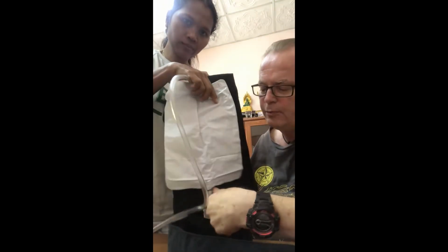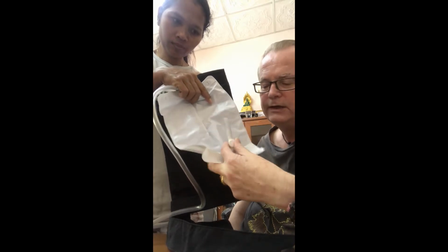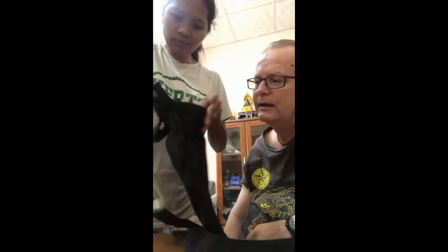Now what you do with your bag, you want to always fold the outlet pipe, because when this bag gets full, it puts a lot of pressure on that pipe and it starts leaking. So by folding it, just before you put it into the bag, it takes all that pressure off that outlet pipe, so the likelihood of any leaking becomes very small. So May's going to put it in now very quickly, and you'll see the TP bag 8 by 11 fits perfectly.